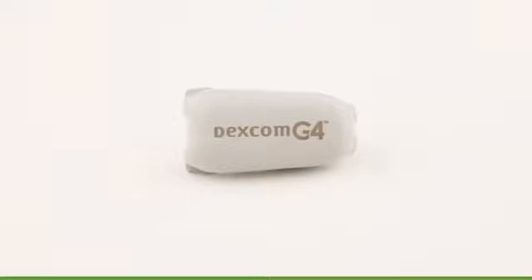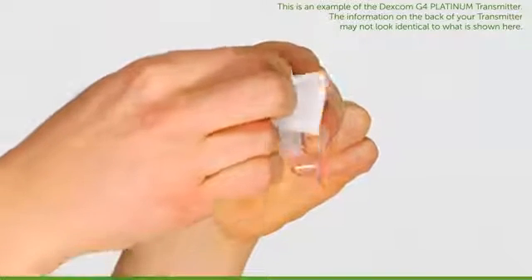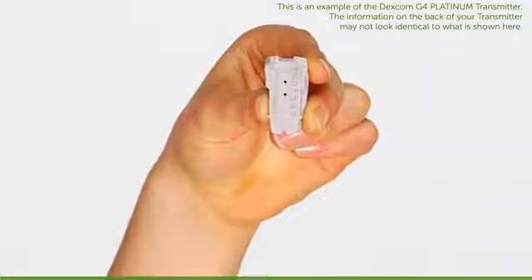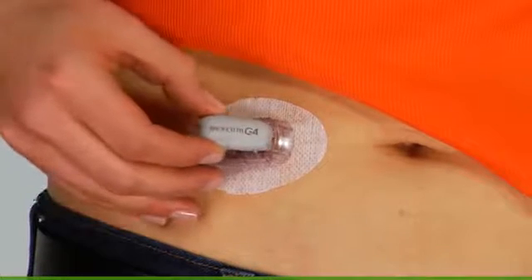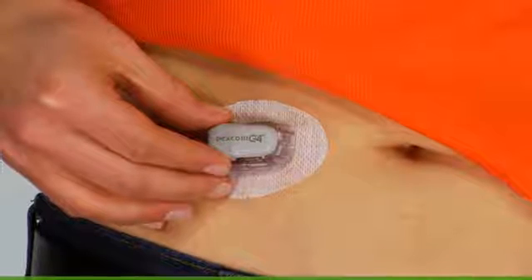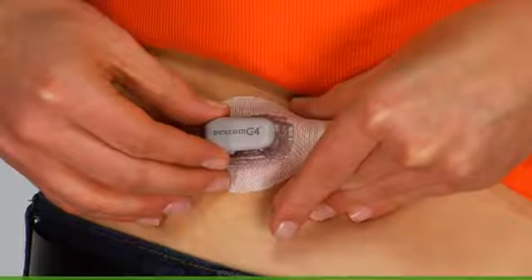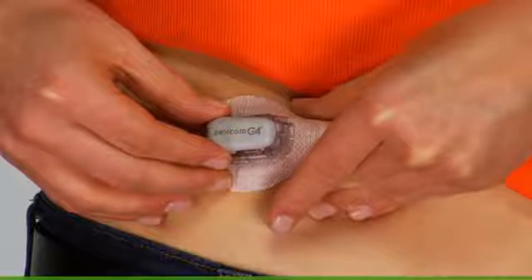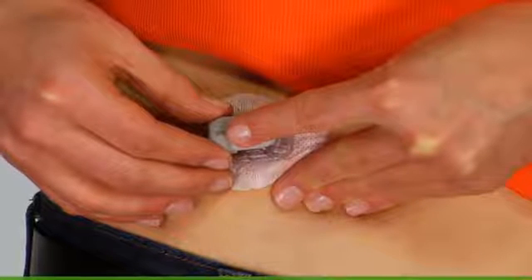Once your sensor has been inserted, it's time to attach the transmitter. First, if you haven't already done so, clean your transmitter with an alcohol wipe and let it dry. Once it's dry, place your transmitter into the sensor pod, flat side down, thinner side away from the transmitter latch. With one hand, you may want to pinch up on your skin at the front tips of the white adhesive. Use a finger to hold the transmitter in place.